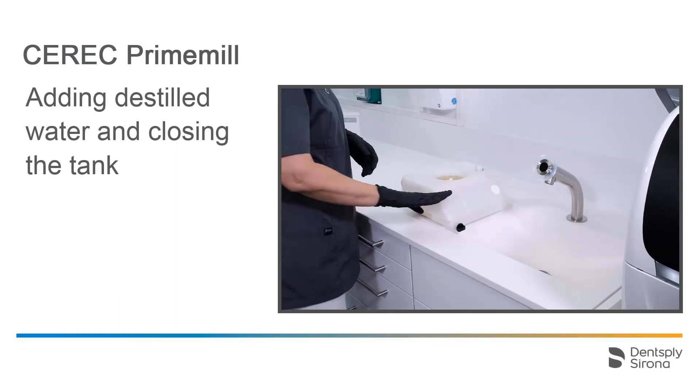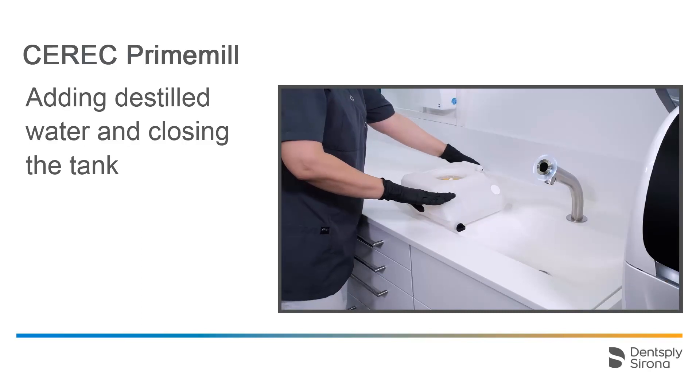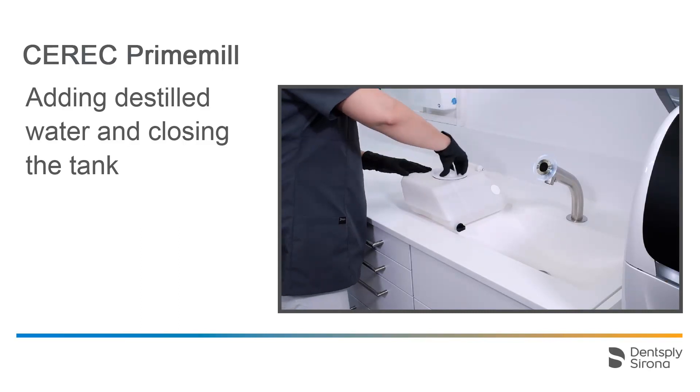We have filled the tank up to the mark, or until the filter insert is covered, with distilled water, and we close the tank. It is sufficient to tighten the tank cap clockwise by hand. Do not use the tank cap opener.